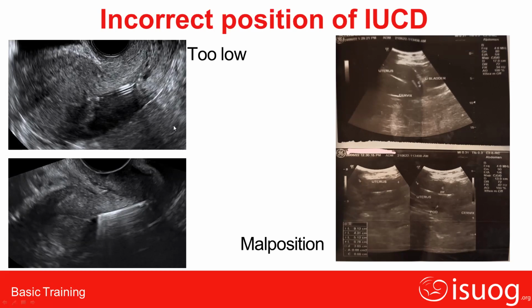Right. And sometimes I have seen cases where the IUCD is not present in its normal position, and one of the shafts, in the transverse one, has gone into the myometrium, and this woman was always complaining of pelvic pain. So her symptom was pain, and on examination, the IUCD had perforated, gone outside the endometrium, and one of the shafts was present in the myometrial region.